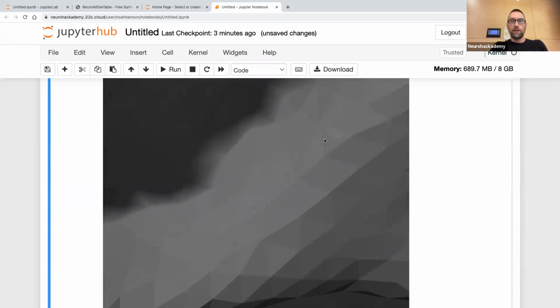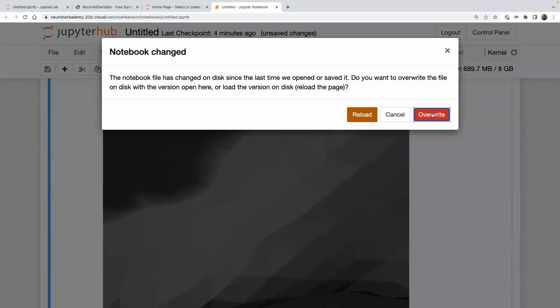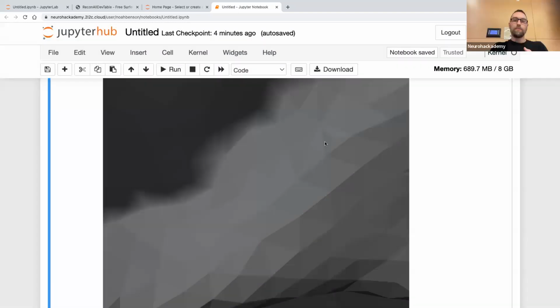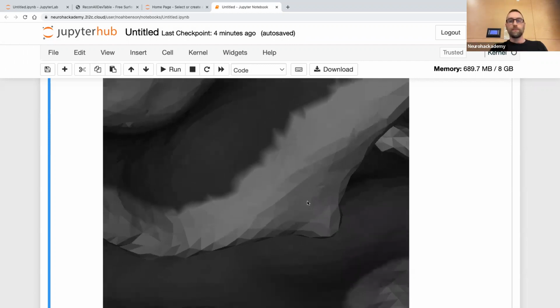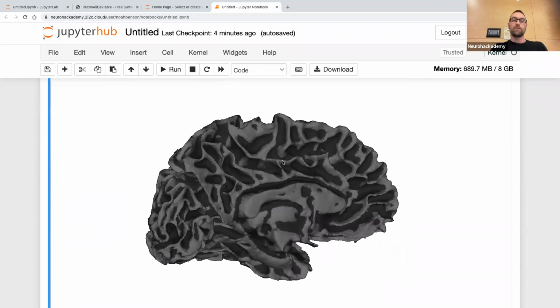You can probably see right here that there's 3 little tiny triangles inside of this one, whereas this triangle over here is quite a bit bigger. So obviously the triangles aren't perfectly uniform here, but they do capture the surface very nicely. So that's sort of the second thing that FreeSurfer does, is come up with these surface models, which are all made of triangles and vertices.